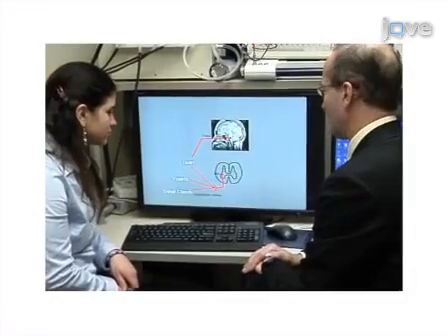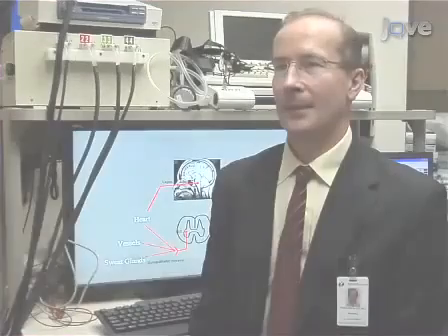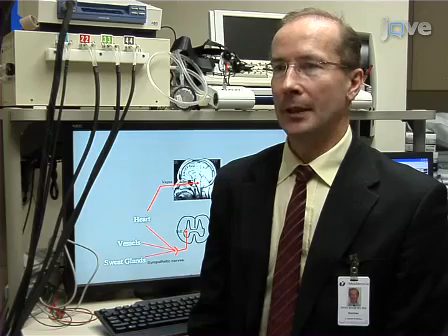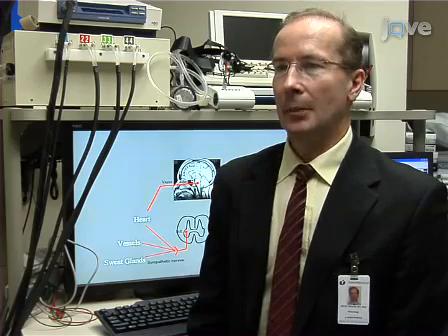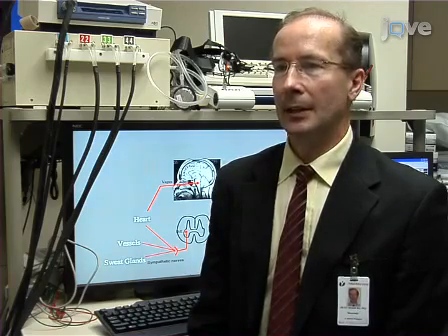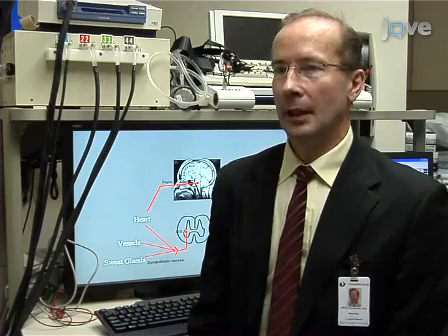Ultimately, these assessments can demonstrate not only the presence or absence of autonomic failure, but also the severity and distribution of autonomic failure. This test method can help answer key questions such as: does the patient suffer from dysautonomia? Does the patient have autonomic neuropathy? These methods also help address whether the dysautonomia is clinically relevant, help determine the distribution and severity of autonomic failure, and help determine how to treat the failure.